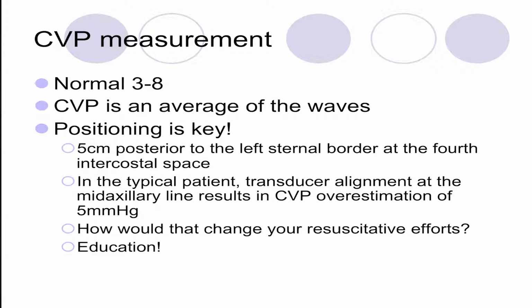What's very important in these patients is a trend. So if you have the ability to hook up a CVP early, you want to do that. Because if we get into problems with urine output, or does this person need more fluid or fluid taken off, the answer is, what has their CVP trend been?